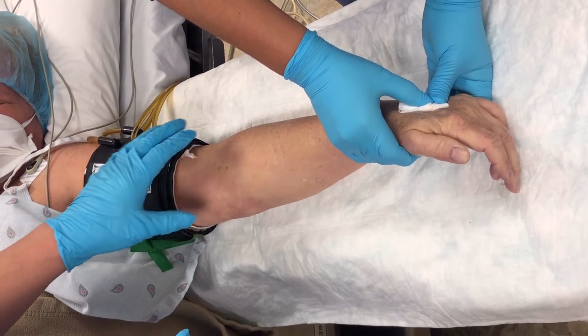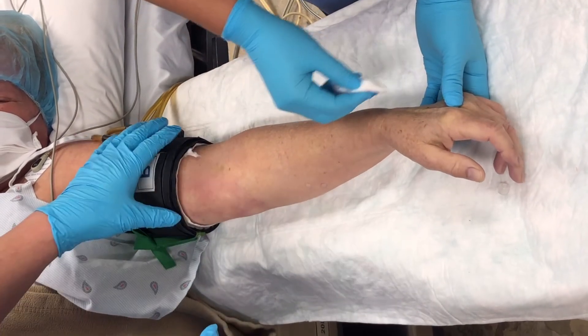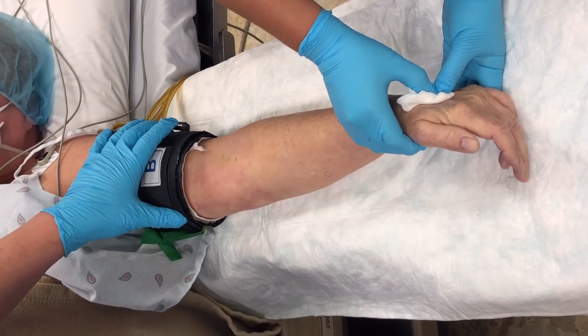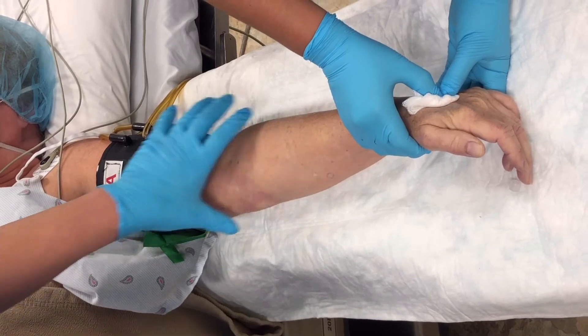But if the surgery is very fast and finishes in only about 10 minutes, you still need to keep the tourniquet on for about 20 to 25 minutes before releasing it, because you don't want to release all that lidocaine into the body at once.